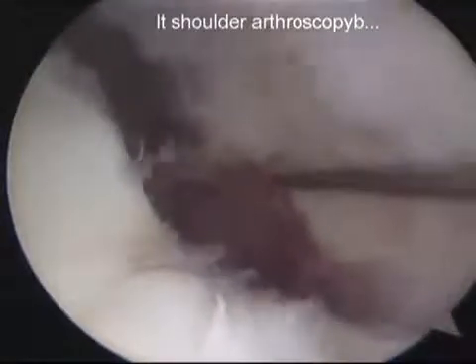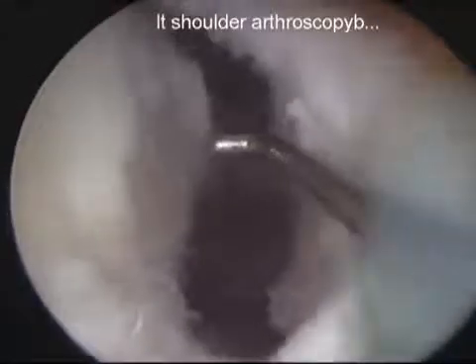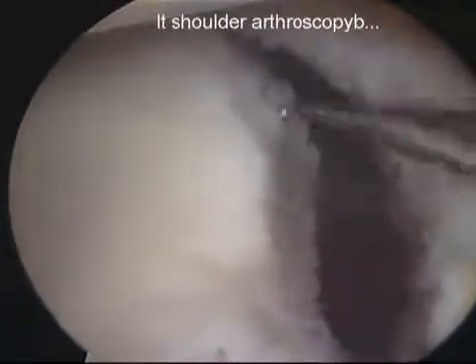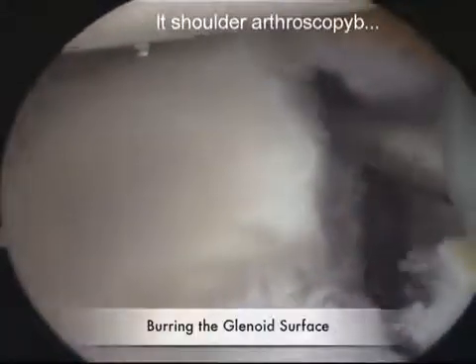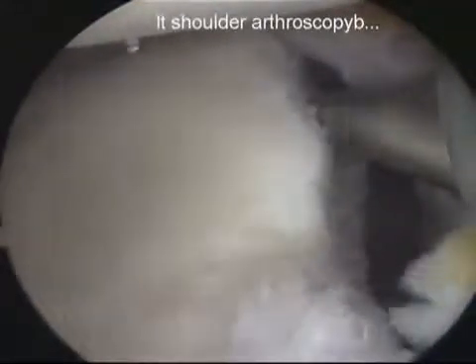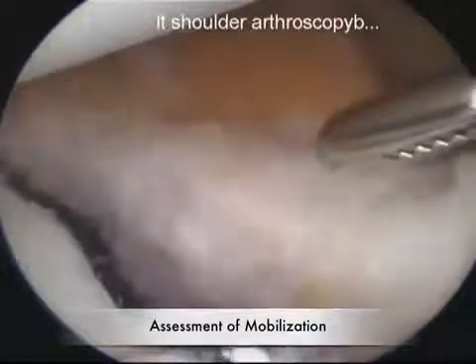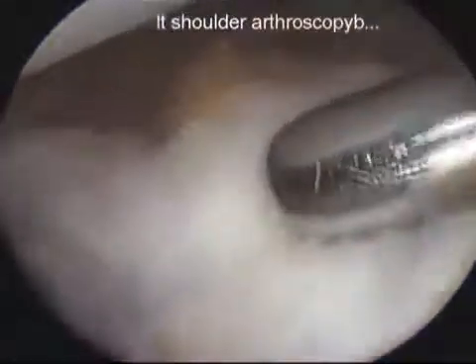The fragment must be mobilized above the glenoid face to achieve adequate exposure for drilling. The glenoid is also assessed for anchor placement and fragment reduction. A burr is then utilized to freshen up the bony surfaces in an effort to optimize healing. Again, the fragment is assessed for mobility as the grasper is brought through the anterior-inferior portal.